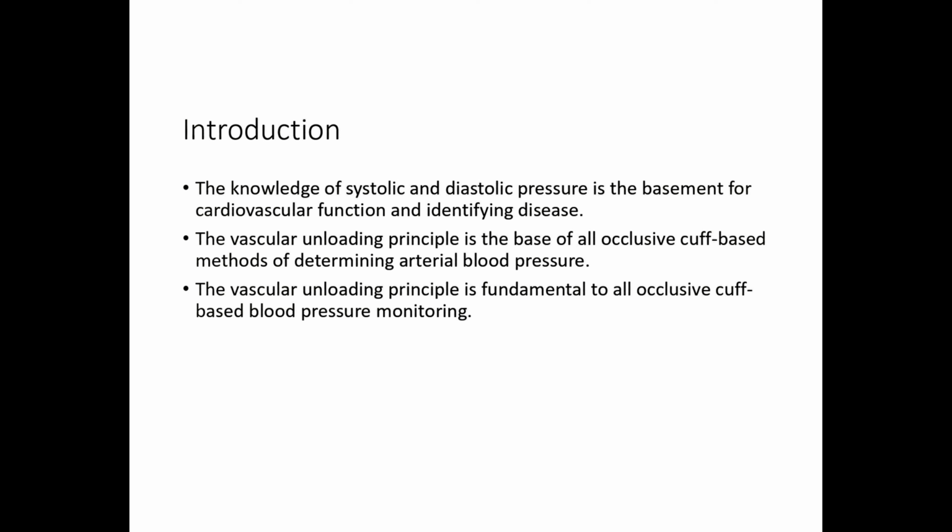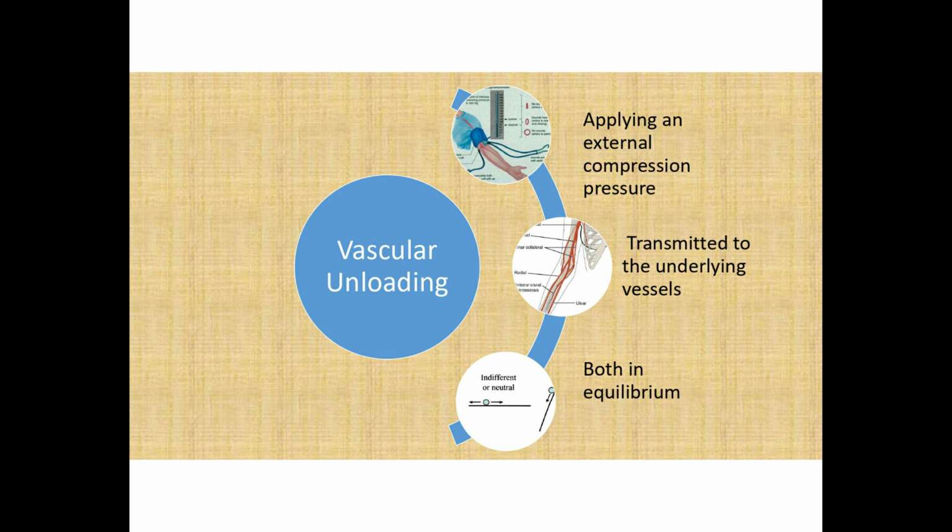That is the base of all occlusive cuff based methods used to determine arterial blood pressure. The vascular unloading principle is fundamental to all occlusive cuff based pressure monitoring.